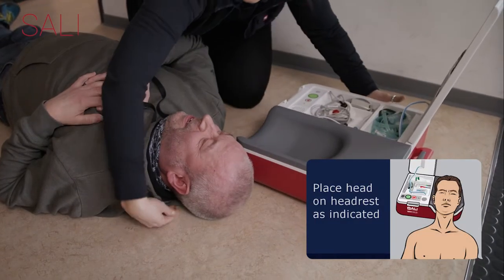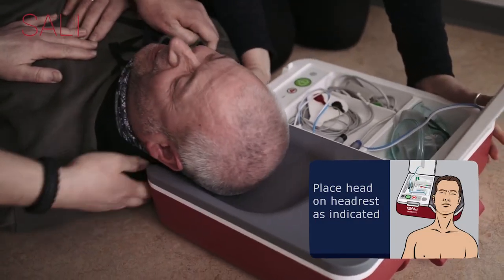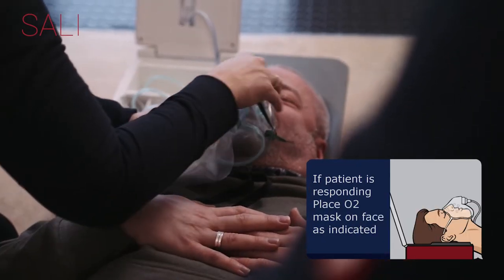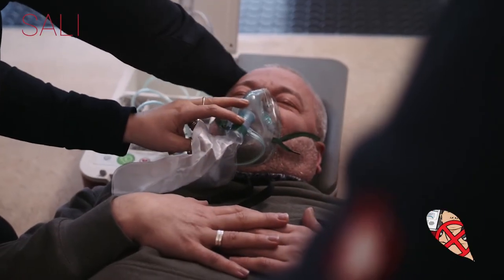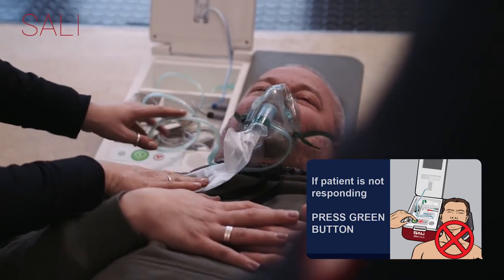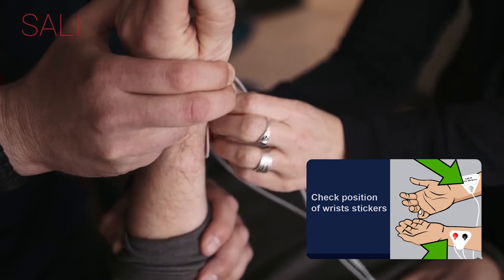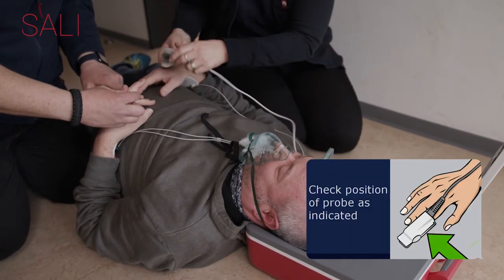Place the patient's head on the headrest. The system's headrest opens the patient's airway non-invasively. If the patient is responding, place the mask on the face. If the patient is not responding, press the green button. Attach both stickers to the wrists, then attach the probe on the index finger.